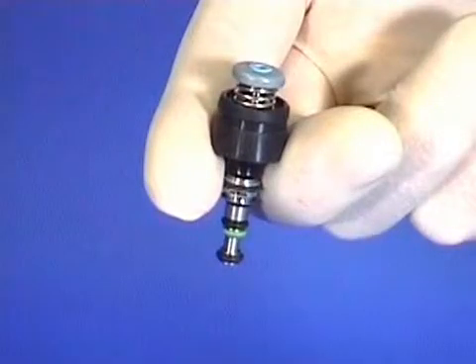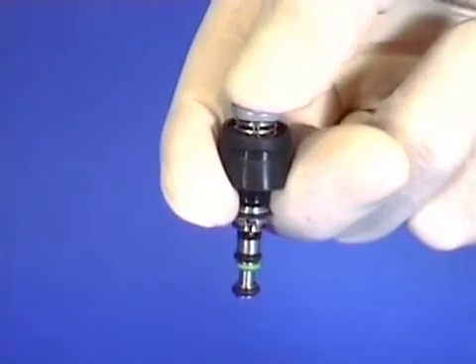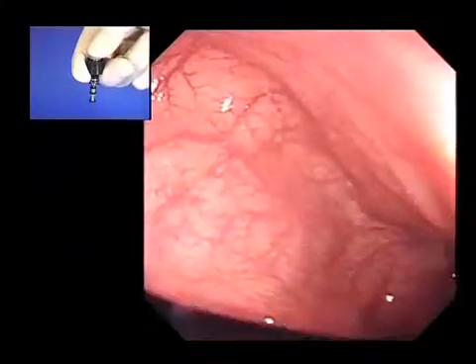Just covering the CO2 valve with the finger does nothing. A light press causes CO2 insufflation. A hard, sustained press activates water wash of the lens.